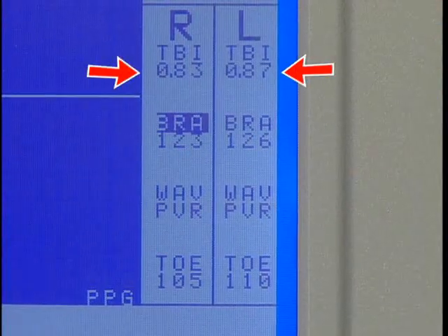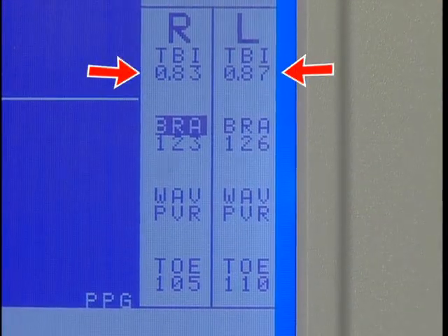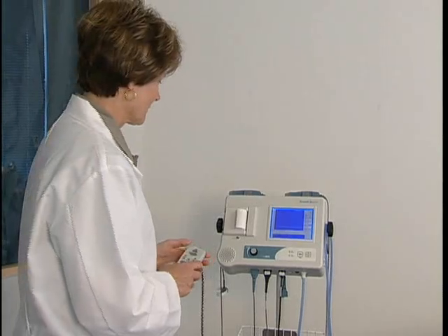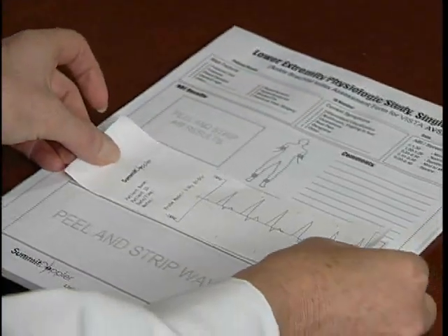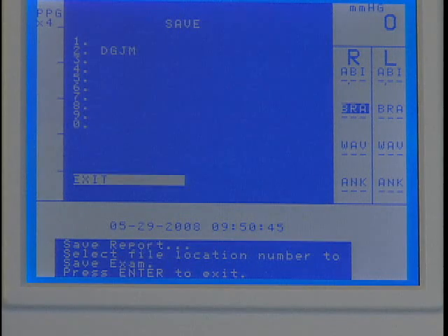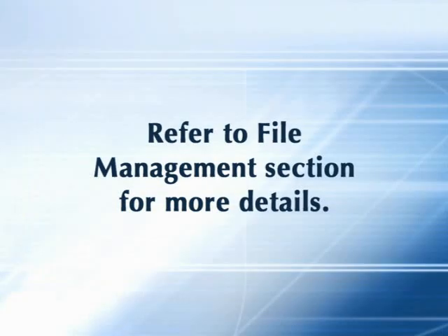At the end of the exam, the TBI results are calculated automatically. After completing the exam, press Print and apply the adhesive-backed labels with the exam results onto the report form. Or save the exam to one of the 10 storage locations as explained in the File Management section of this video.